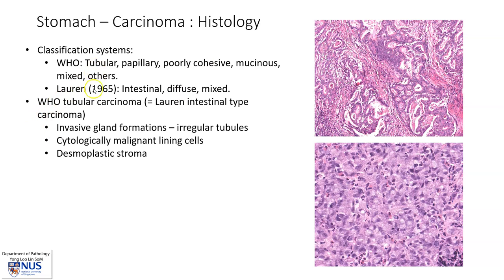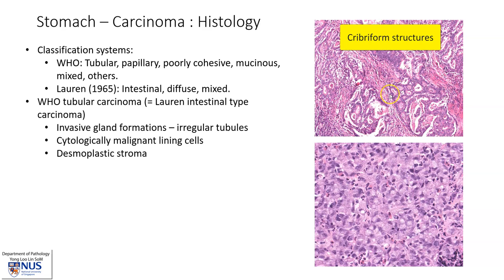The WHO tubular type carcinoma corresponds to the Lauren intestinal type carcinoma, and this is formed of invasive glands. We can see here the tumor composed of many glandular openings, with irregular tubules and sometimes cribriform structures with multiple glandular openings within a single larger opening. These are lined by cytologically malignant cells, and often the stroma in between is desmoplastic with a cellular appearance and some inflammation.